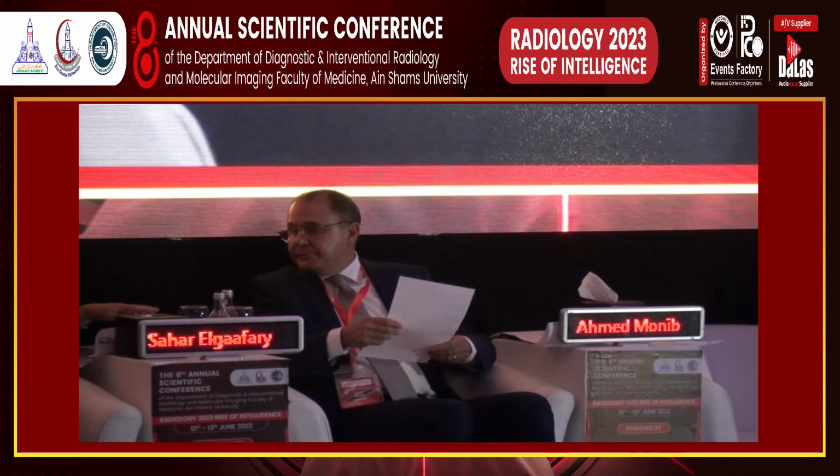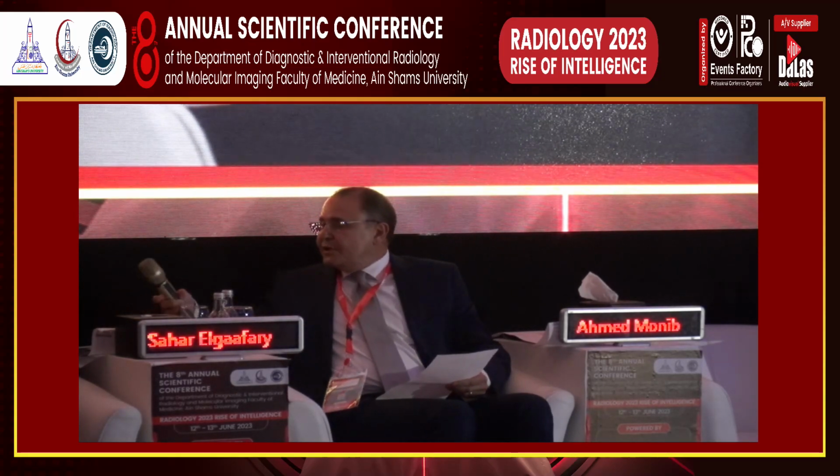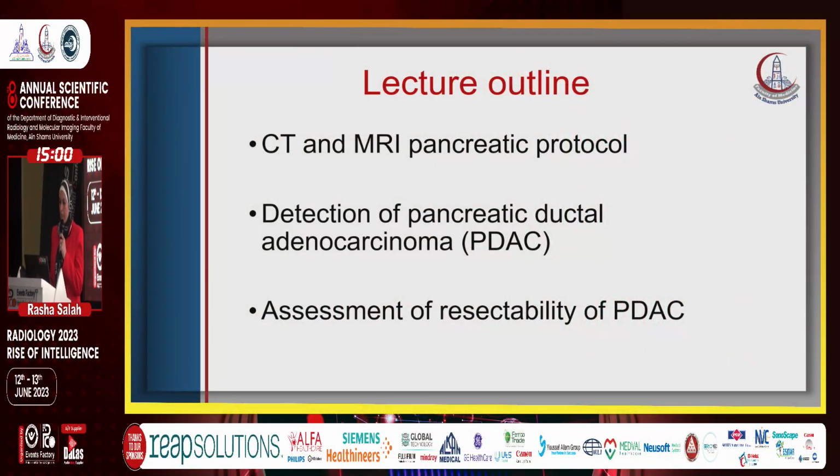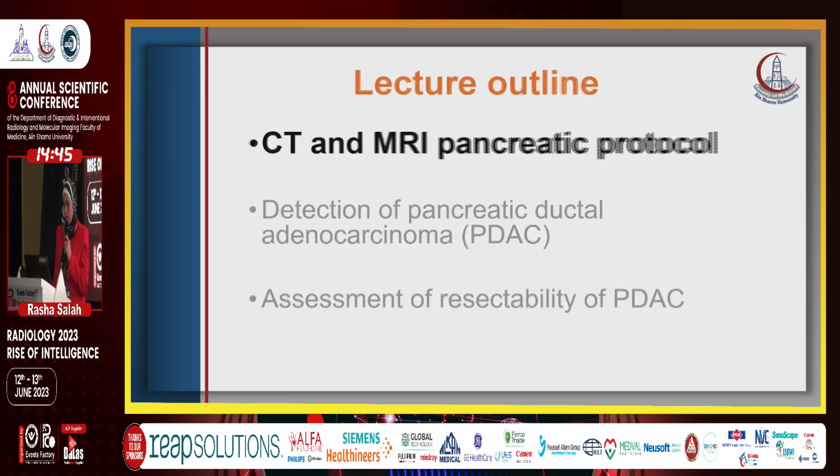Good afternoon. It's my pleasure to be here again with you. Today we are going to discuss radiological imaging in pancreatic cancer. This is our outline. We will discuss the CT and MRI pancreatic protocol and evaluate the detection of pancreatic ductal adenocarcinoma, and also we will give a hint about the assessment of resectability of pancreatic ductal adenocarcinoma.